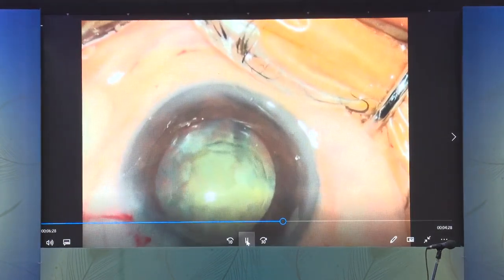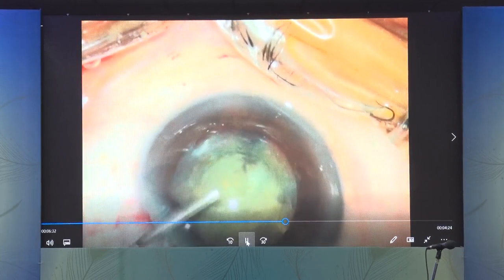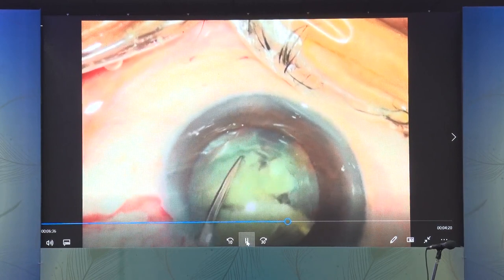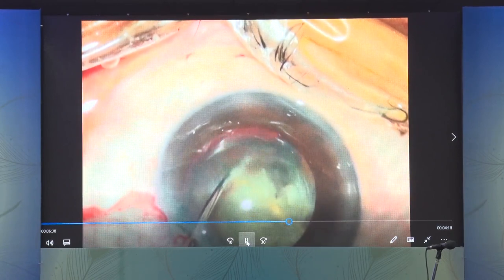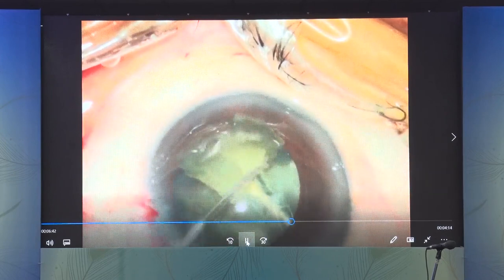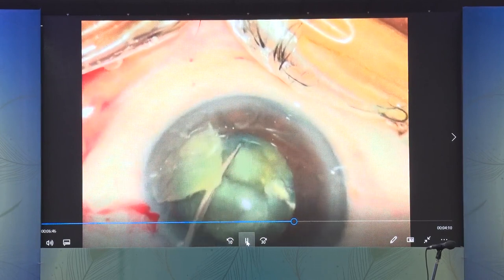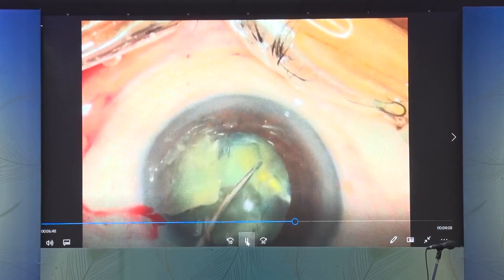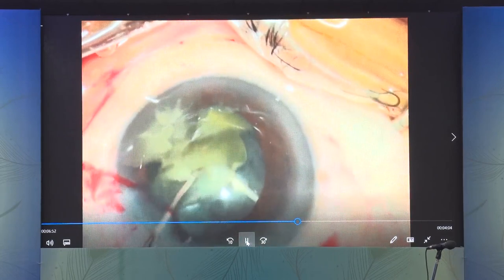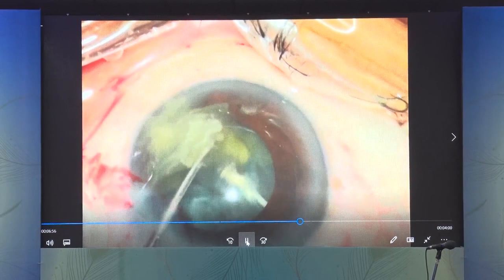The other mistake here — this is a video from over six years ago — is that a 26-gauge needle is introduced into the vitreous with a view of trying to save those fragments and bring them up. Today, I would state that this is definitely a no-no. Any introduction of a needle to try and save the nucleus from going down will cause significant damage to the vitreous base with the propensity of creating holes, tears, detachment, and macular edema later.